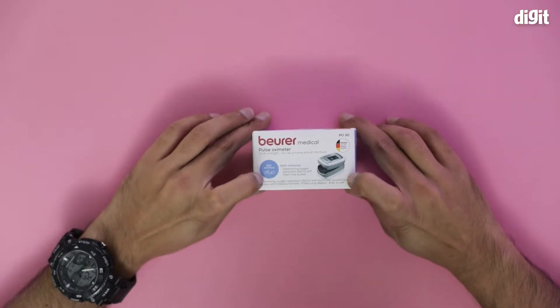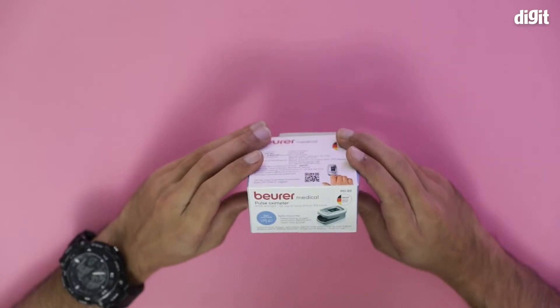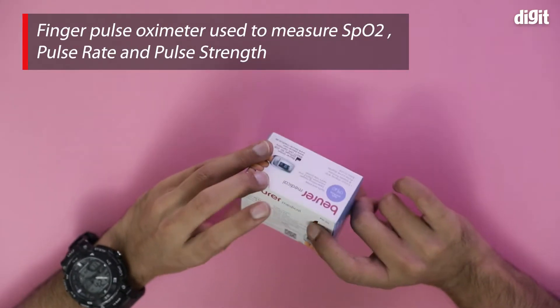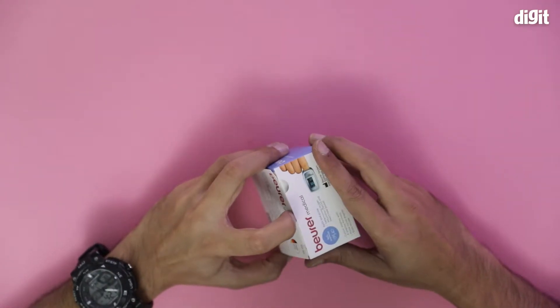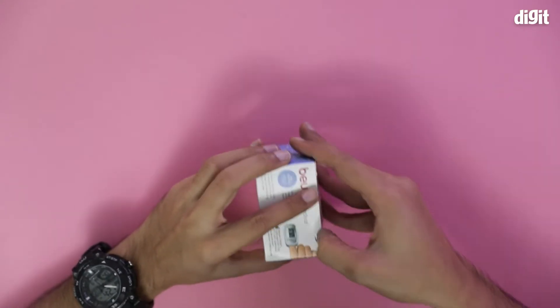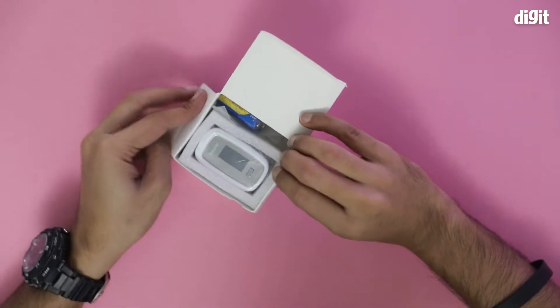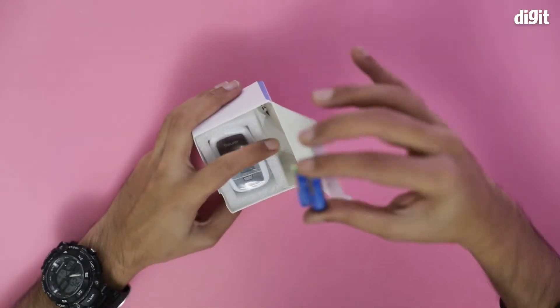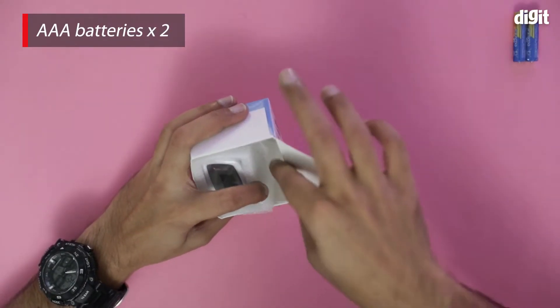There is some extra information here — this is used to measure SpO2 and pulse, which is all it does. It's a fingertip oximeter with two functions more or less. Let's open this box and see what the device looks like and what else comes with it. We have two triple-A batteries, which is always standard.